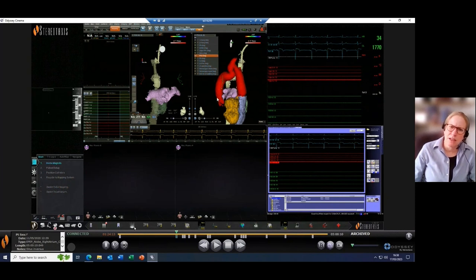And again, here to illustrate the excessive kinking of the aorta, which basically meant that we felt that retrograde is not an option. Retrograde procedures in congenital heart disease are something that we do nearly all the time, so that would have been my first choice. But seeing that aorta, I thought I would not be able to negotiate this path. Now, you also see the azygous continuation here once more.